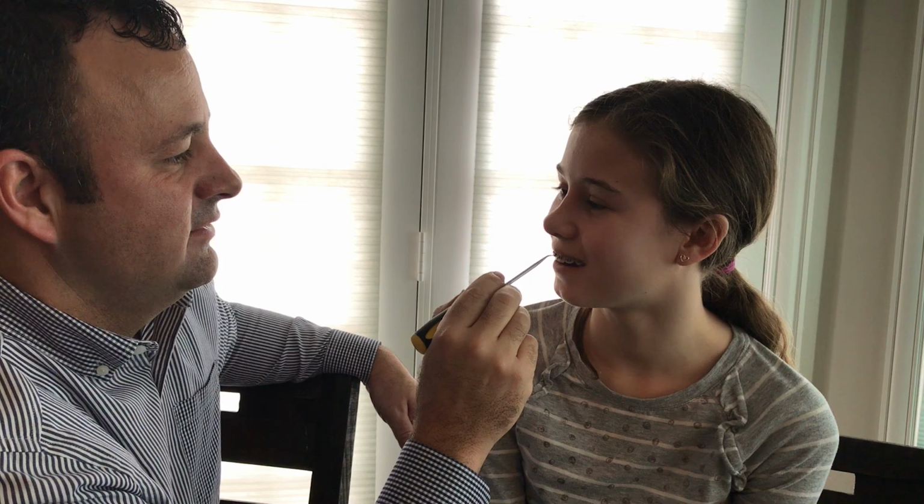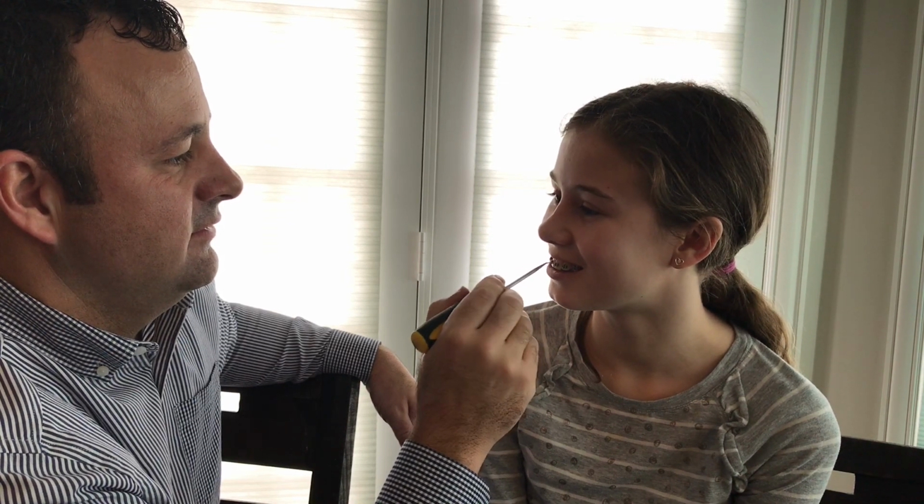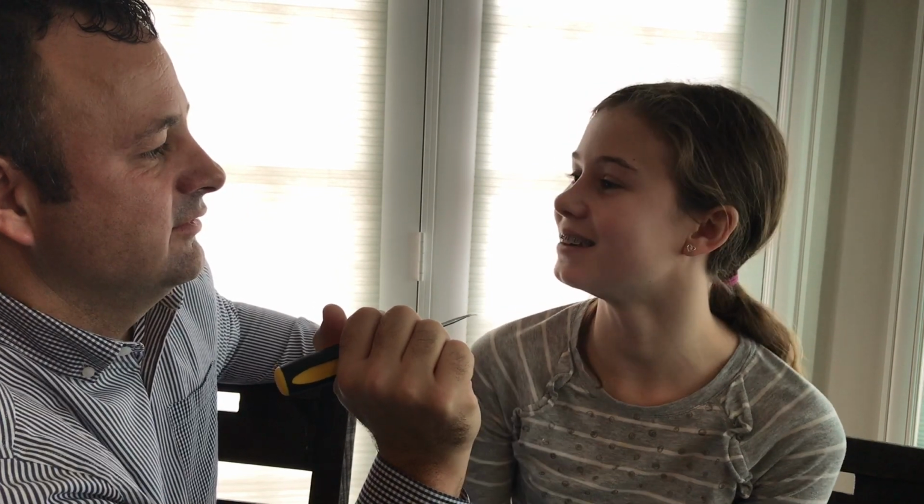So she has a loose wire in the back, and we're gonna try to get it out because she needs it cut because it's poking the side of her cheek. It's dangerous. Then why would we do this? No, the wire sticking out is dangerous in my opinion. Cole, wouldn't it be easier if I just left the rubber bands on, snipped them with a snipper, and pulled it out?